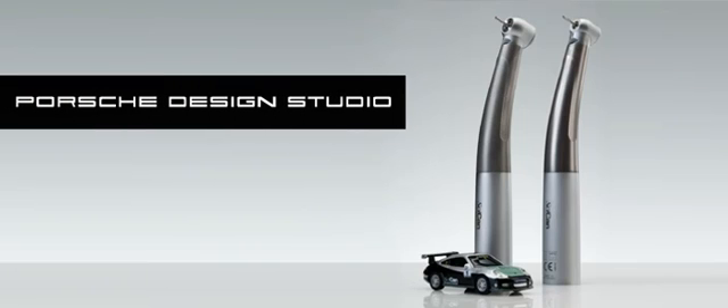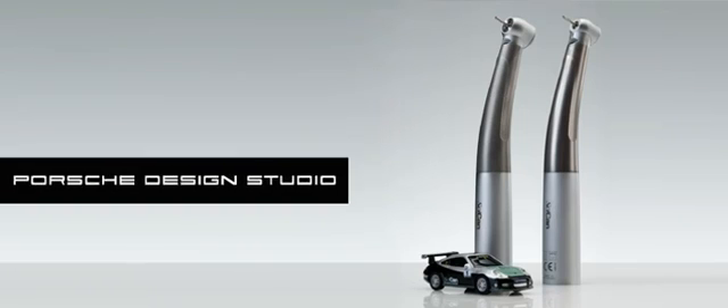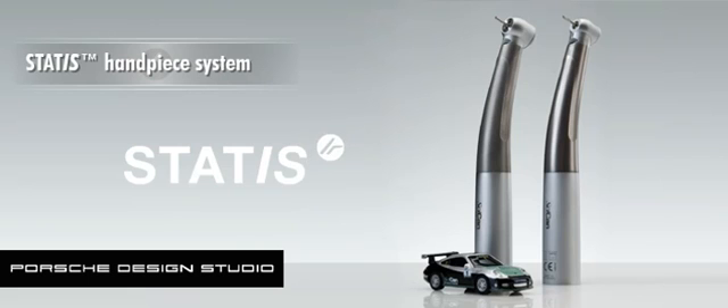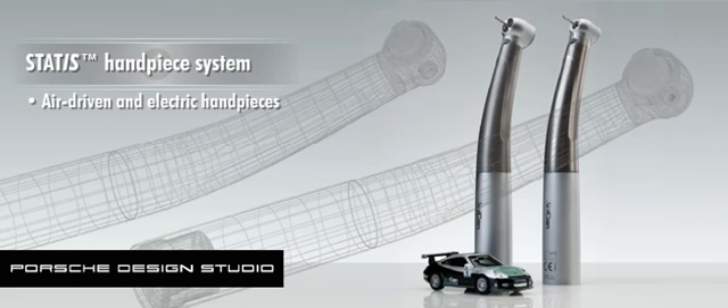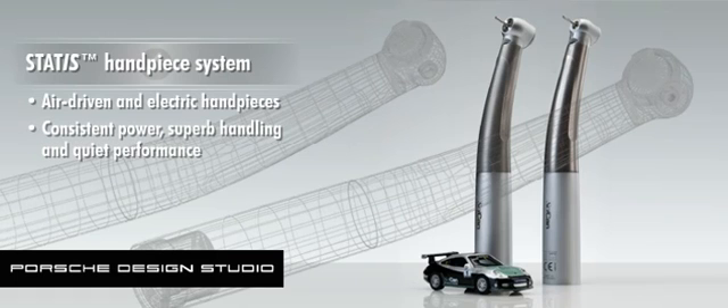Designed in conjunction with the renowned Porsche Design Studio, the STATIS handpiece system offers state-of-the-art air-driven and electric handpieces that combine consistent power, superb handling, and quiet performance.